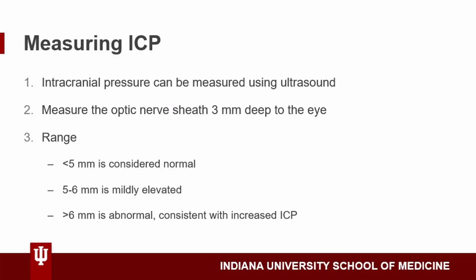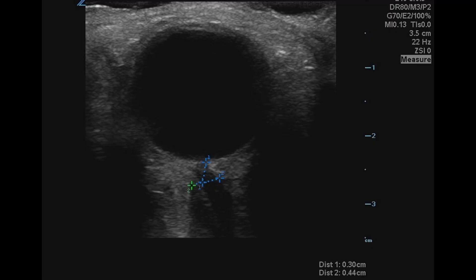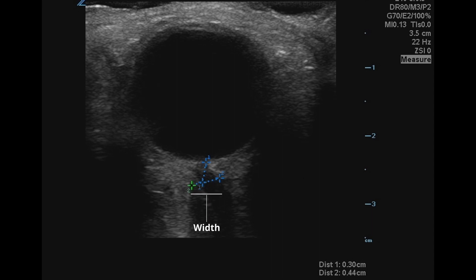Along with ocular pathology, we can also assess intracranial pressure, or ICP, by measuring the optic nerve sheath diameter. Our target is three millimeters behind the eye, with a normal measurement being less than five millimeters. This image from our healthy patient shows an anechoic eye with a vertical blue line measuring exactly three millimeters deep into the nerve sheath. The horizontal line shows us the nerve sheath diameter, which in this case is less than five millimeters. Based on these data, our patient likely has normal ICP.